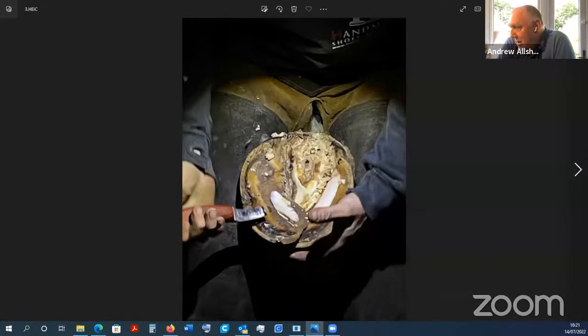My first idea was to make some sort of casing or shoe that goes on the foot, and I discussed using silica gel. For people who aren't sure what that is, it's the same stuff that goes into a baby's nappy, so it soaks up a lot of moisture. It's also used in the lasers on the 3D printers that I use. They put silica gel in the laser head to keep moisture out, and they have a special one which changes color when it gets wet.